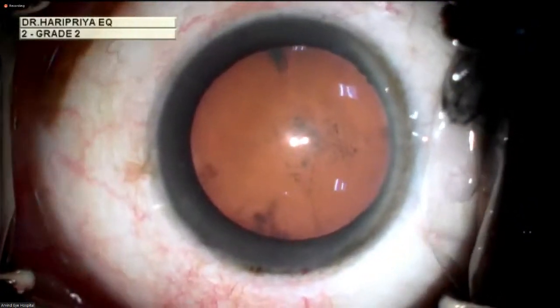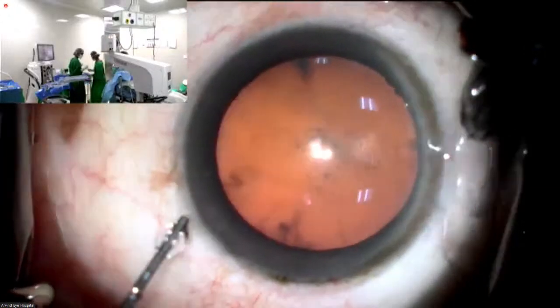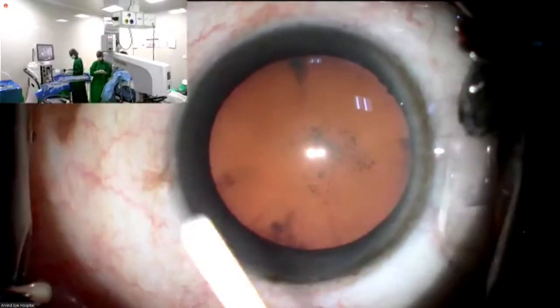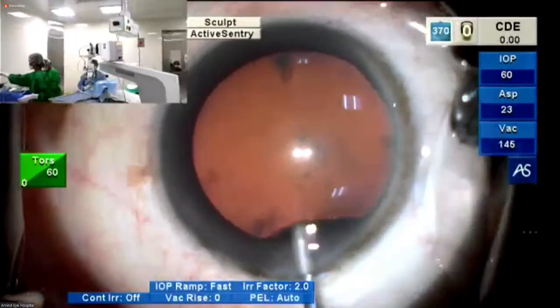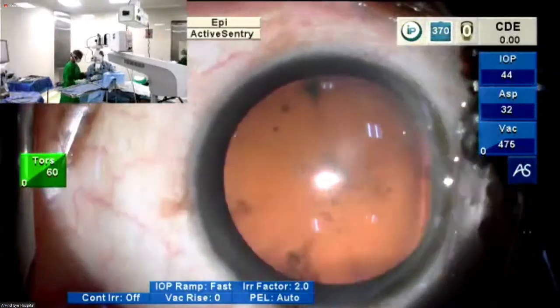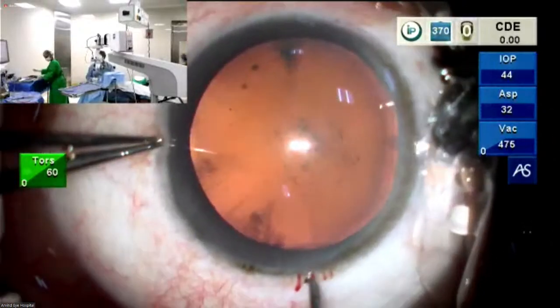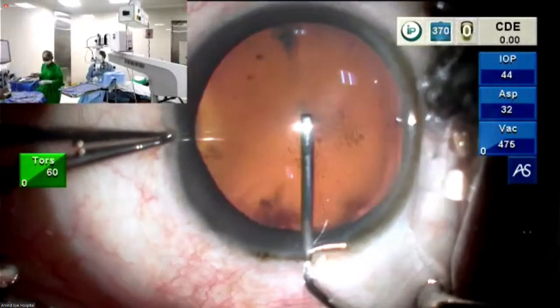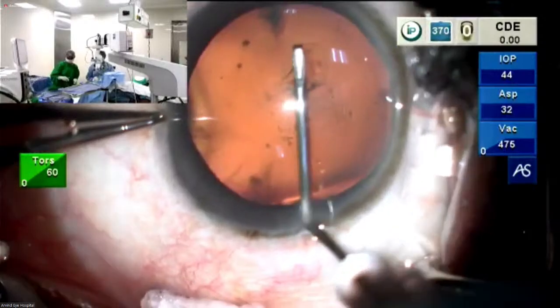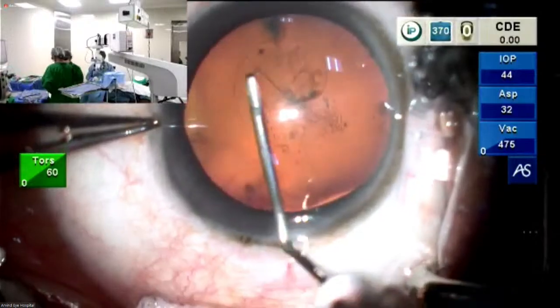In a high myope, as we are aware, the patient obviously has a lot more sensation. They have a lot of pressure because of the iris lens diaphragm retropulsion syndrome. So here, normally I don't change my settings for the myopes. Again, in myopes, the capsule can be a little more elastic because they are younger and with the cataract. So the capsulorhexis here is done with the cystitome. I prefer to do the rhexis about 5.5 millimeters.